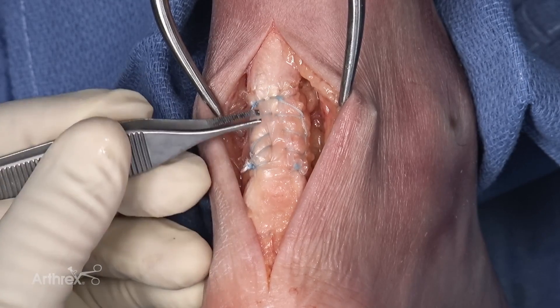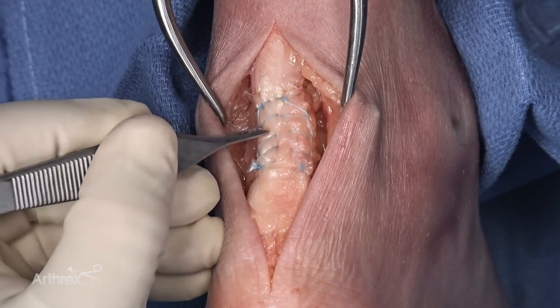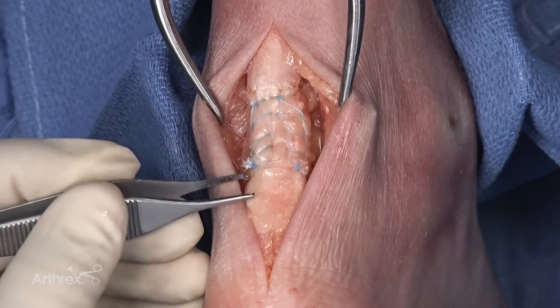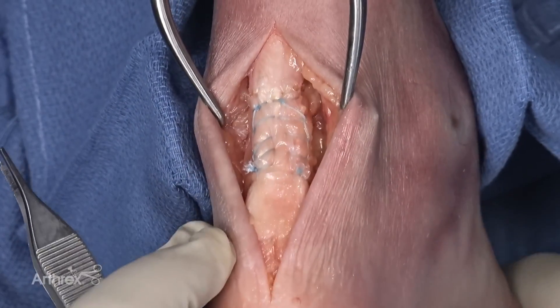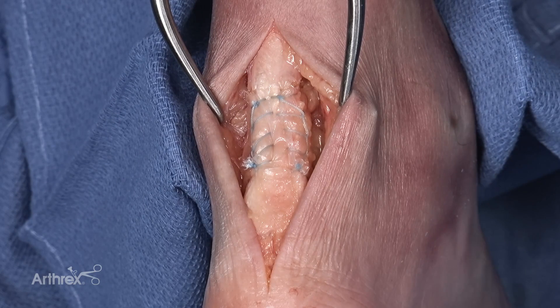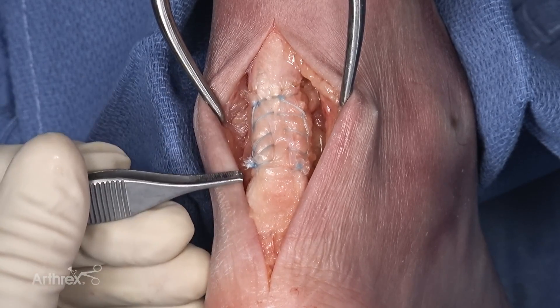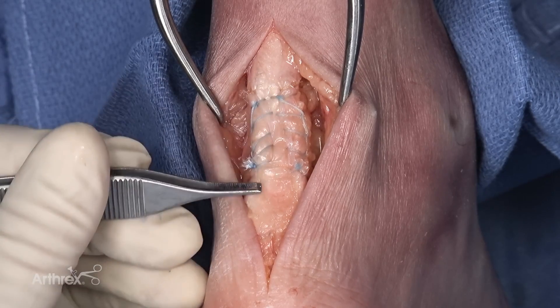The importance to reiterate about the repair is that this scaffold — now if I take my forcep and try to lift my scaffold off of the tendon — that scaffold is bound down with our running interlock suture. As we take the ankle through range of motion and stress our repair, the high tensile strength nature of this product assists with intraoperative stability and also gives us post-operative benefits as we get cell attachment and ultimately tenocyte migration.